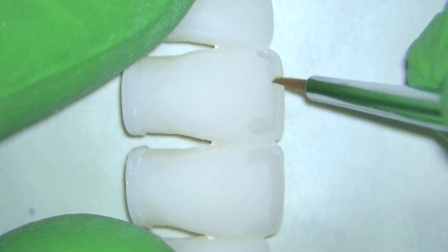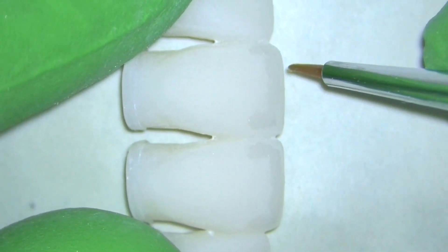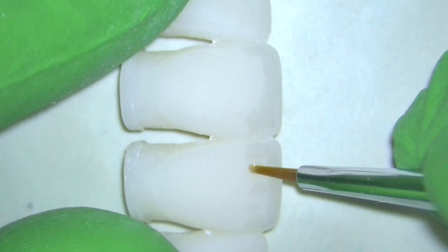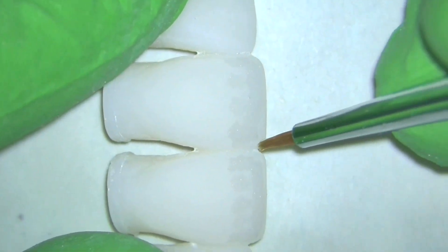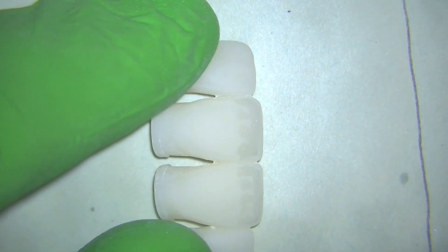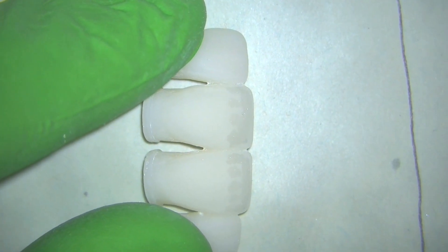We want this to be subtle — we don't want this to stand out and look artificial. So all I'm doing here is thinning it out and making it look a little bit more subtle, maybe adding a little bit more and dragging it down into the middle portion of the tooth kind of irregularly, just to add some of that translucency down towards the middle of the tooth, and then I'm going to cure it with my curing light. You can appreciate what that looks like after step one of stain.